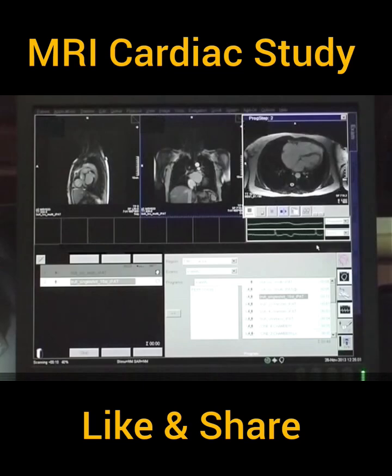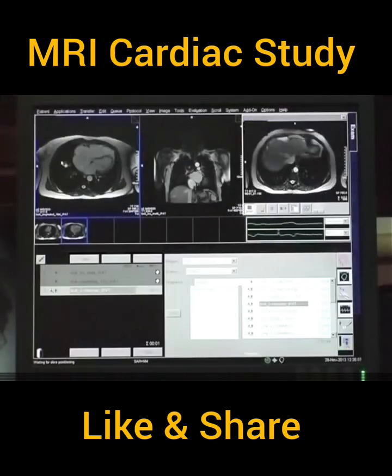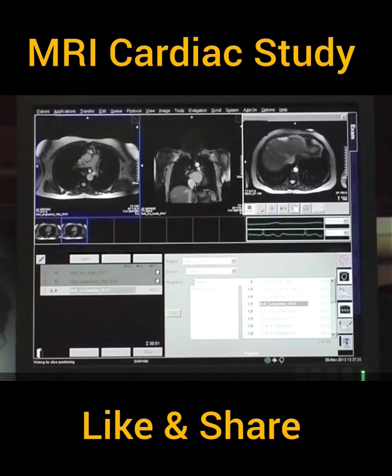The right atrium and right ventricle are moderately dilated. The wall of the RV shows crenations. The RVOT is dilated. The MPA is normal in size.